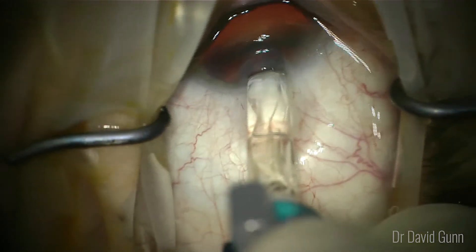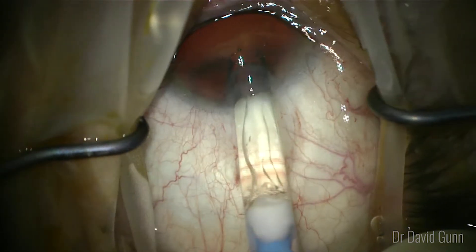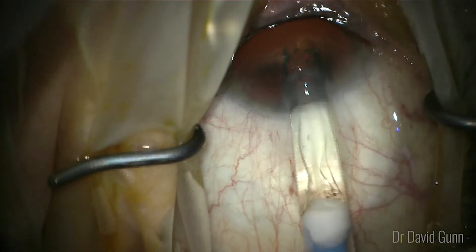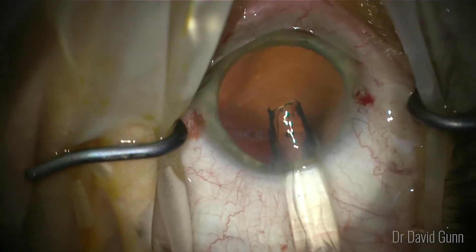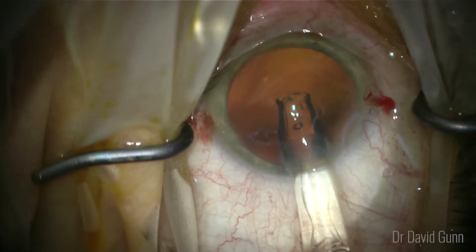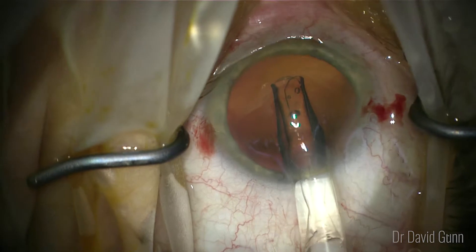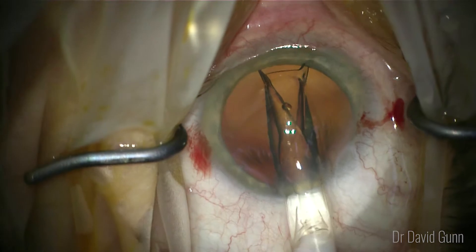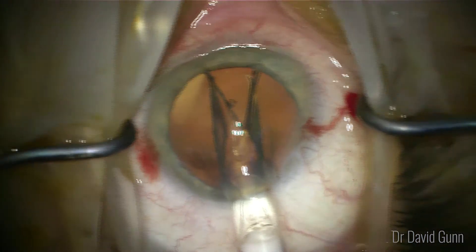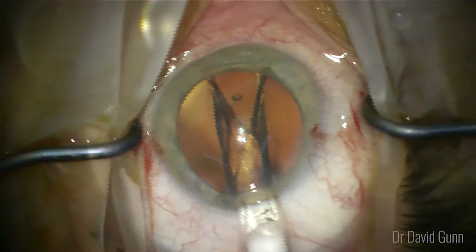Once we pass the lip of the wound, the eye is brought back to neutral and we very, very slowly inject at this stage to try and work out the orientation of the lens. What we're looking for is on that right leading plate haptic we should see a circle, and that tells us that the lens is oriented correctly upright. It's important not to rotate the cartridge at this point and just give the lens time to unfold on its own.